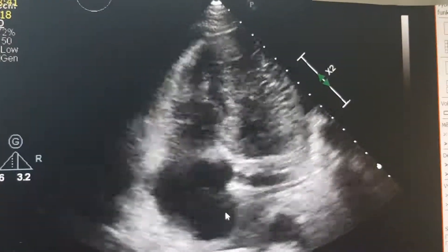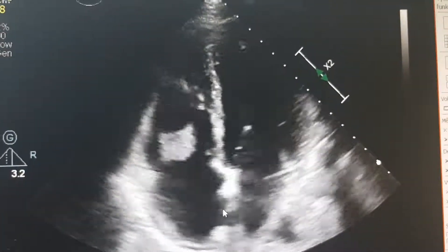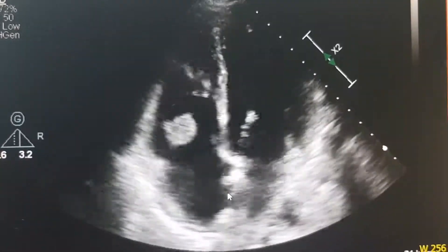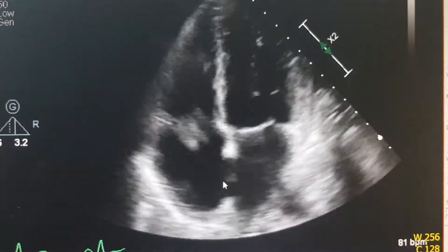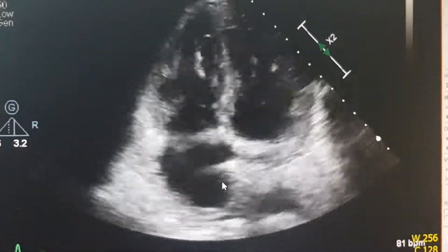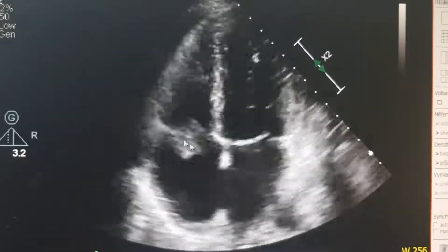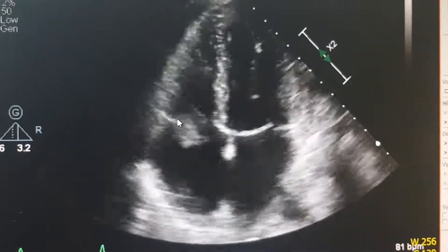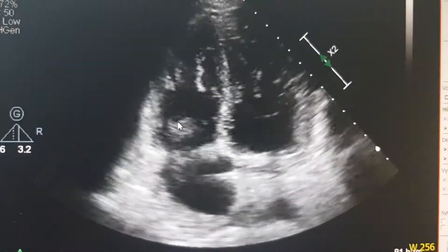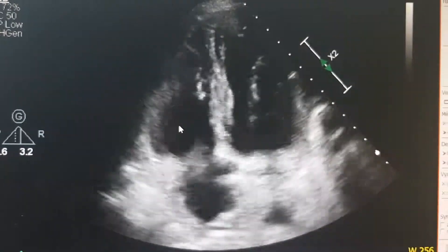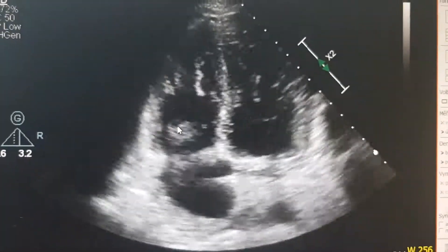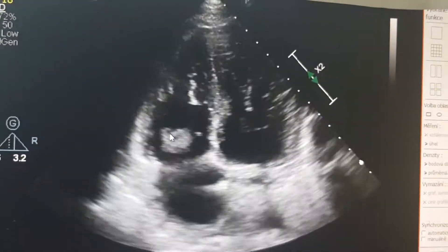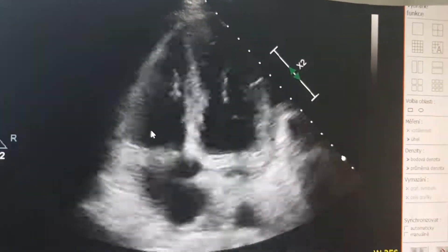I just wanted to show you two cases of infectious endocarditis of a native tricuspid valve. The first is a 28-year-old woman who came to the ER for a months-lasting fever, problems with breathing, and pains of the joints and of the arm and the leg.